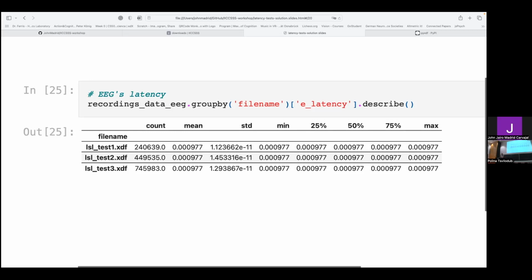That's why you want to measure the time from time 0 to the next one, and the next one to number 2, from number 2 to number 3. You always just want to measure that distance. It's not all of the times with respect to 0, but the times between each of the samples. Because sometimes it could be, sorry?